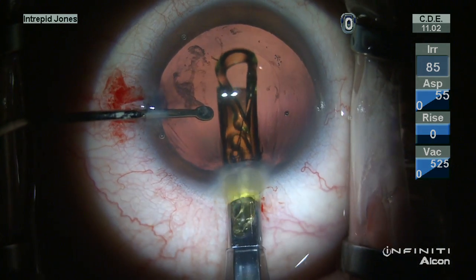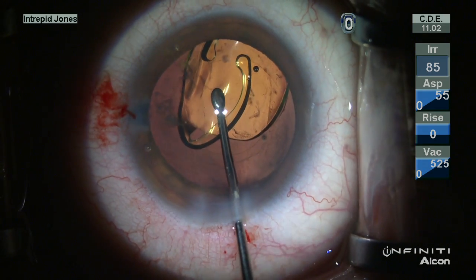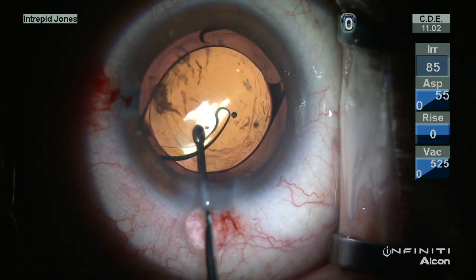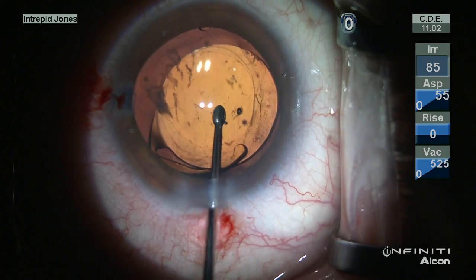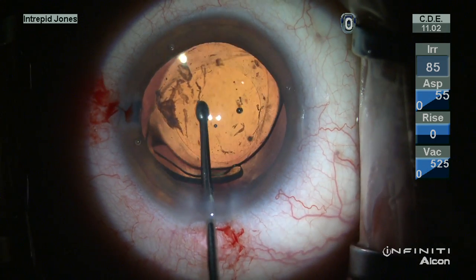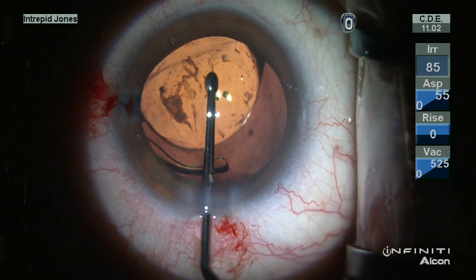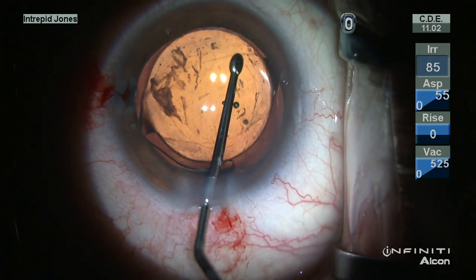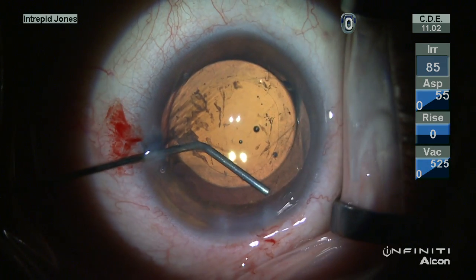A single piece acrylic lens is delivered in a routine fashion, very uneventfully, right into the capsular rim. Once the haptics are liberated, the optic is then prolapsed through the posterior capsulorhexis by simply slipping one side in first and then the other. Some slight maneuvering of the optic allows for the lens to center well.